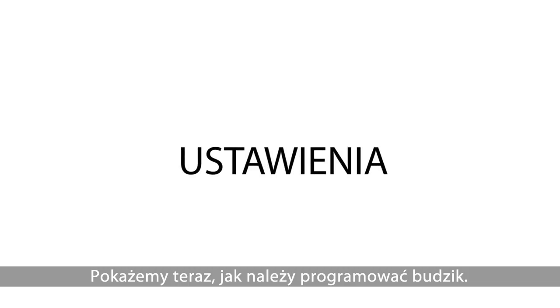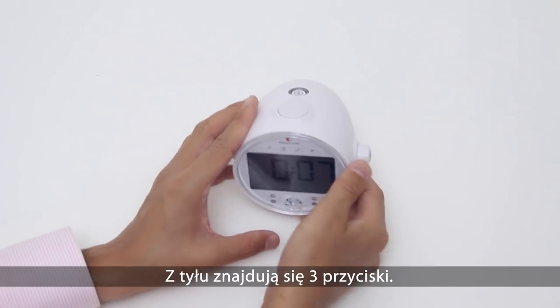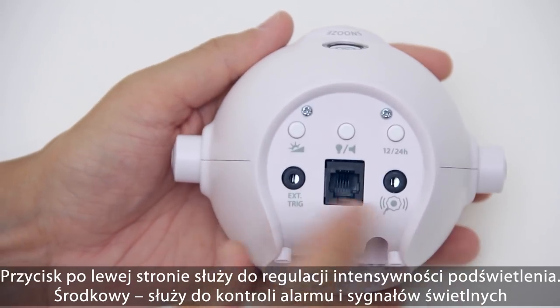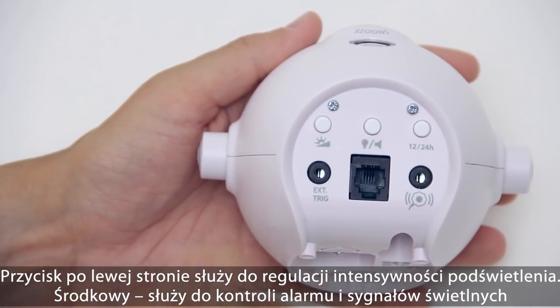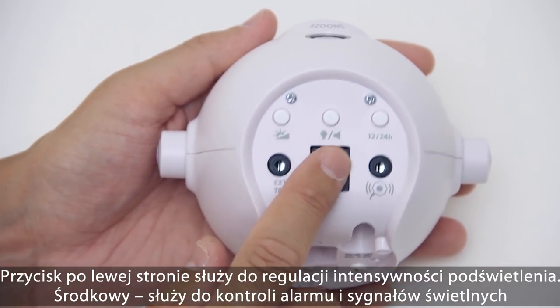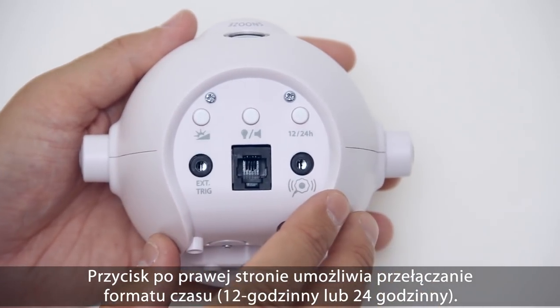Now let's have a look at how to customize your alarm clock. At the back side there are three buttons. The left one controls the clock face backlight intensity. The middle one controls the alarm and flash. And the right one switches between 12 and 24 hour time formats.